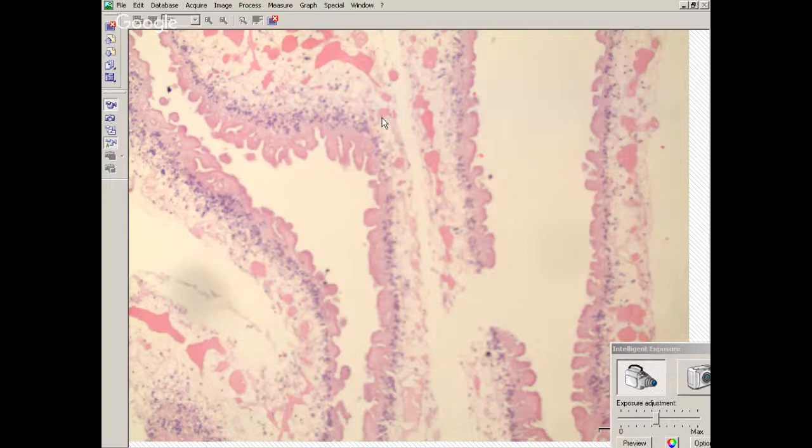In the brain, in humans, it'll degenerate, and the body will resorb this. It'll cause a reactive change. So if you can recognize that this is a cysticercosis radiographically, the protocol is not to do surgery. It's just to leave it alone and do anti-seizure medications if a seizure is why it was identified, which is usually the case.